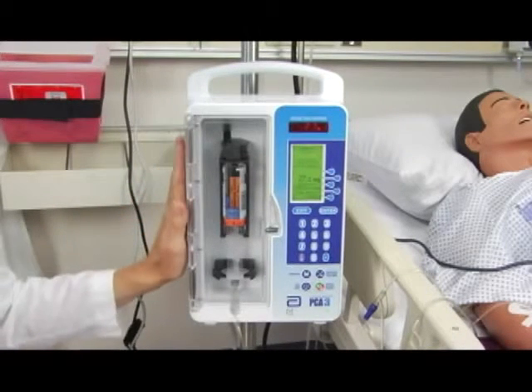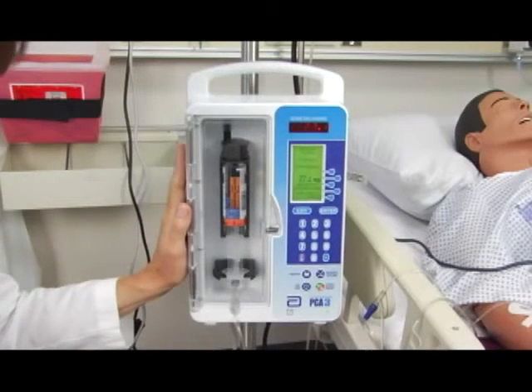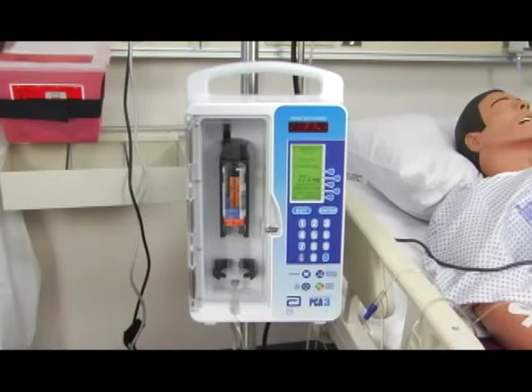All of this needs to be confirmed with the second nurse, and the PCA record filled out, and 2 signatures are required on it. And you'll wash your hands when you're done.